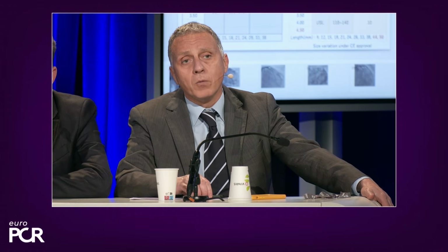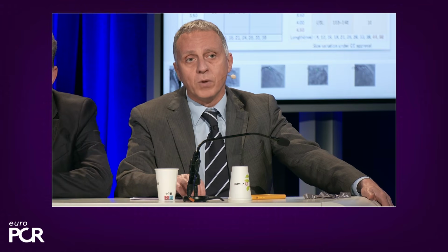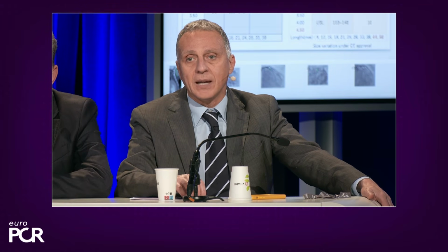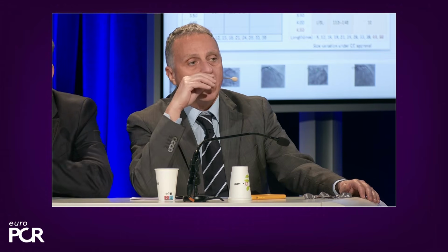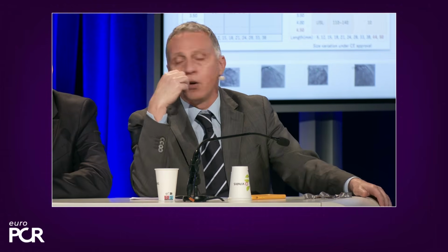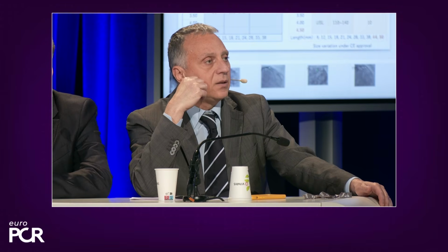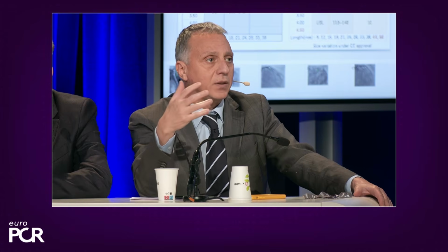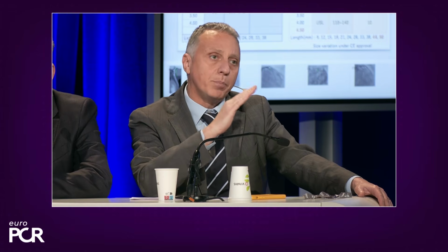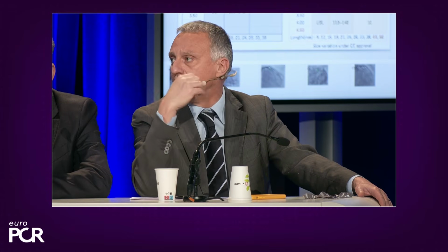So when we practice this, we always perform a POT that exceeds a lot the ostium, so that we flare the ostium of the stent.